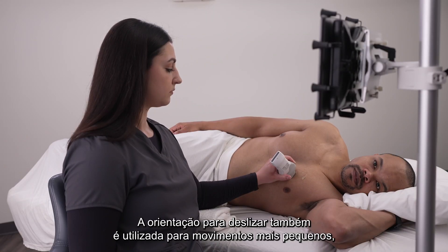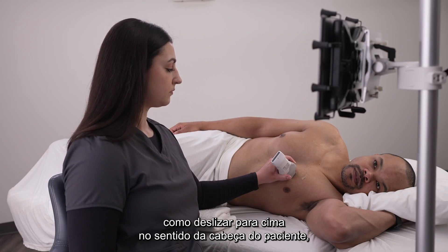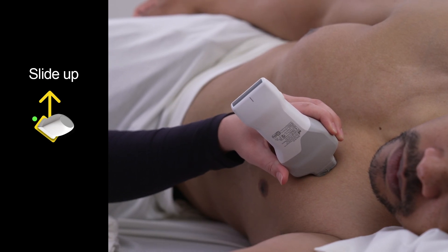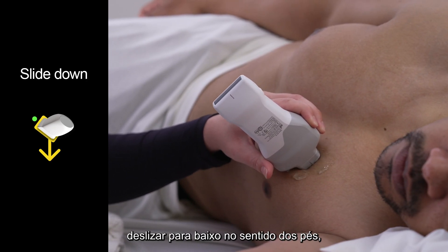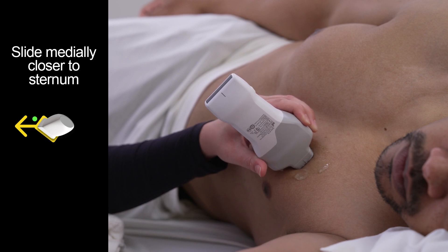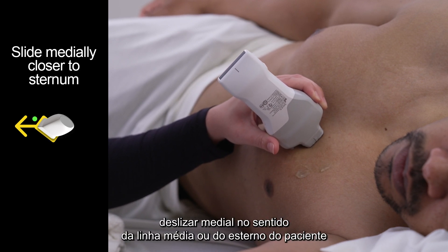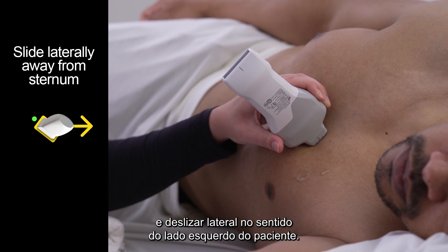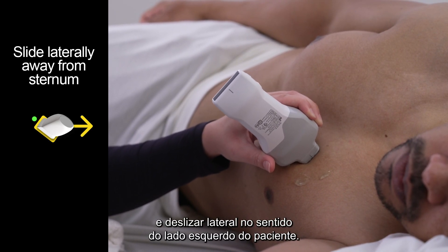Sliding guidance is also used for smaller movements, such as sliding up towards the patient's head, sliding down towards the patient's feet, sliding medial towards the patient's midline or sternum, and sliding lateral towards the patient's left side.